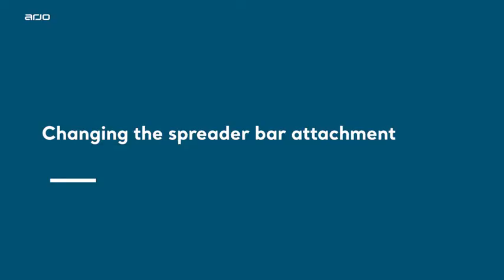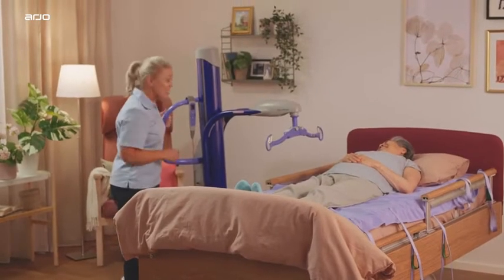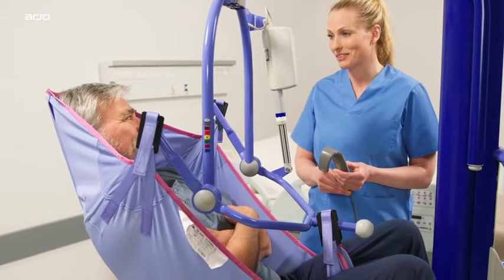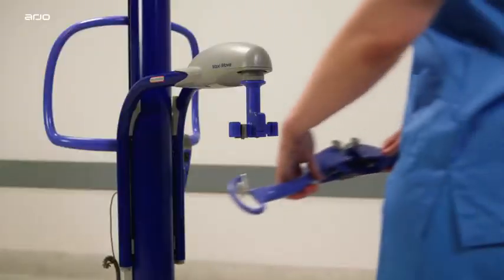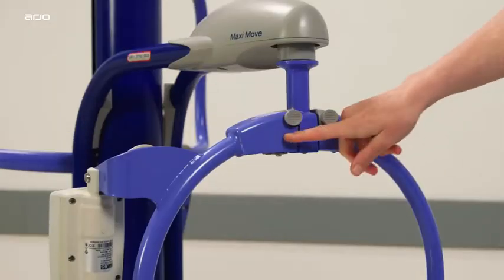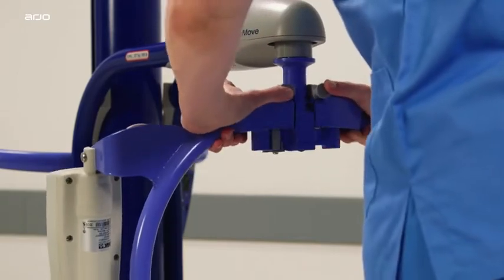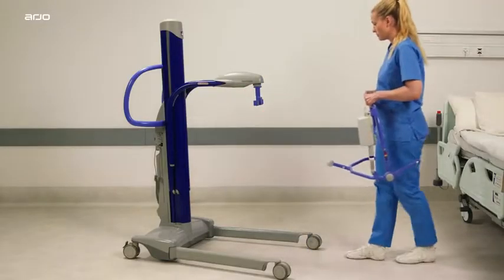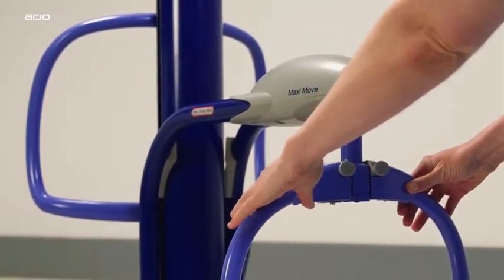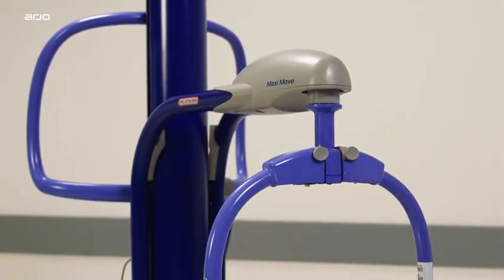Spreader bars for MaxiMove: the MaxiMove has been designed with multiple attachments to meet different patient transfer and repositioning needs, including various spreader bars and stretcher frames. To install a spreader bar or stretcher frame, hold the attachment securely. With the locking clip thumb pads facing you, allow the recess in the attachment to fit around the T-bar shaft. Ensure the attachment drops down over the T-bar and that the locking clip engages fully. Arjo has added a smile to show that the spreader bar has been attached correctly.